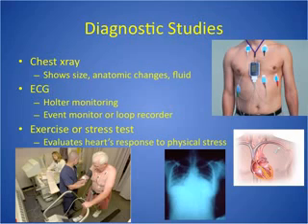There's also an implantable one, and that's what you're seeing here on the right, that of course is indefinite, and it will record when something happens. So when it gets triggered by a dysrhythmia, it would record slightly before, slightly after. And these can also be used for telephonic pacemaker checks and other things.